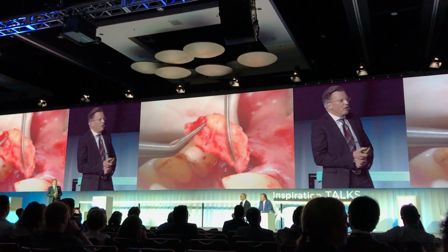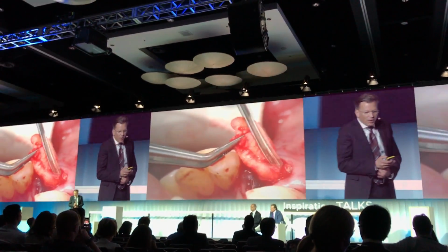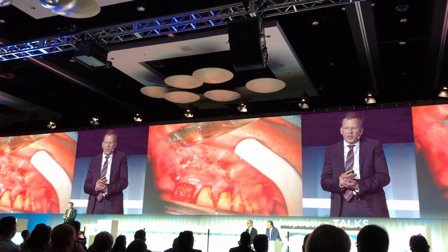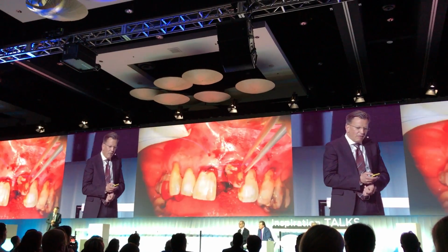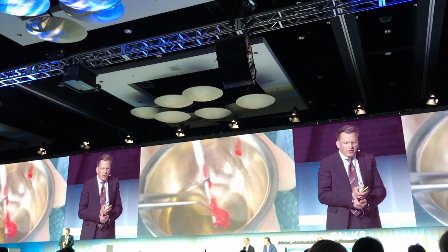We make a tunnel at the facial aspect according to Allen, which is a little bit more extended when you would like to move the tissue complex more coronally. You have to extend your tunnel more to the lateral aspect. And finally, you graft again with autogenous bone chips the defect on the facial aspect.